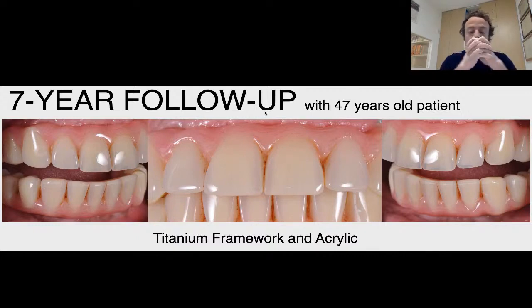And they like to do a comparison, like changing the wheels on a car, no? Every 5 years you have to change the wheels on the car, and so it's normal to change the teeth in the prosthesis every 5 years. Honestly, I don't totally agree with this kind of statement, because in my opinion, to change the teeth in the prosthesis is not like changing the wheels on the car. It's like changing the engine in the car. Because it's an important job to do.